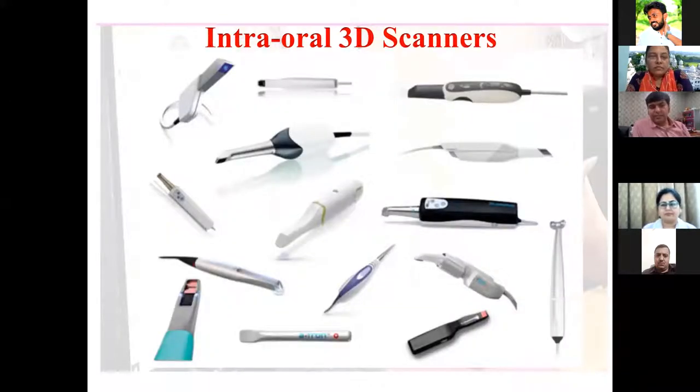The commonly used intraoral scanners available are shown in this slide, which we are using. Today we will be demonstrating the Trios 3D intraoral scanner from 3Shape. Another is available from Planmeca, known as Emerald, and another one is available from Dentsply Sirona, the Cerec scanner.